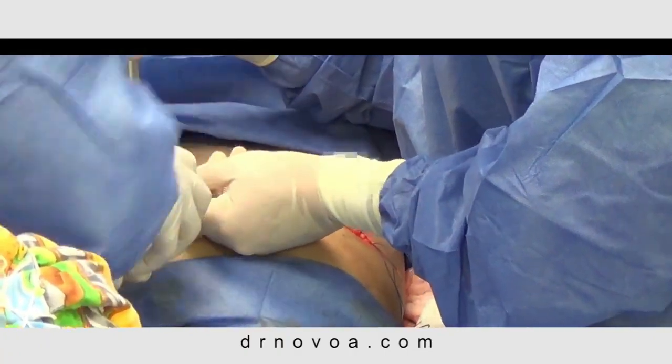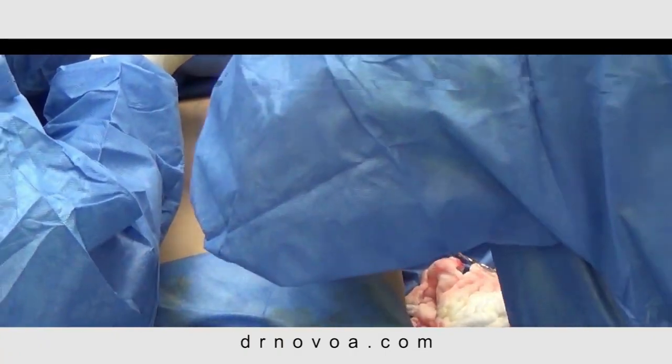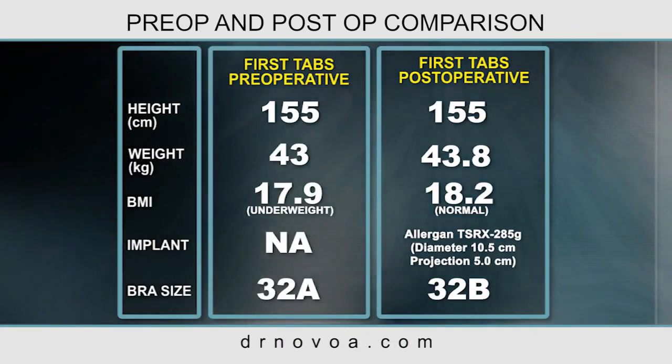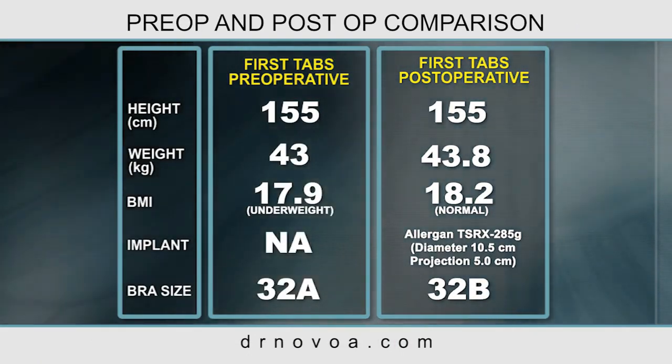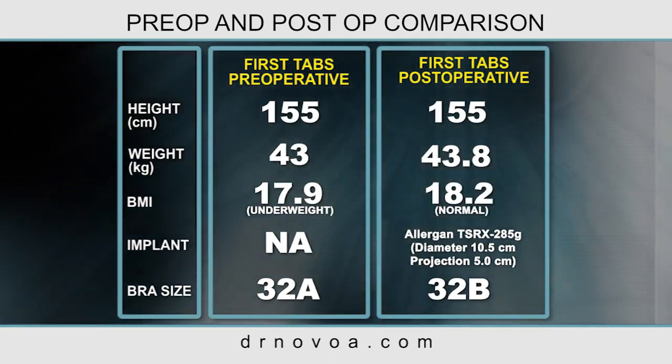TSRX textured implants are then inserted using a funnel and the incisions closed. During her first surgery, the patient opted for a 285-gram textured implant, increasing her bra size from a 32A to a 32B.